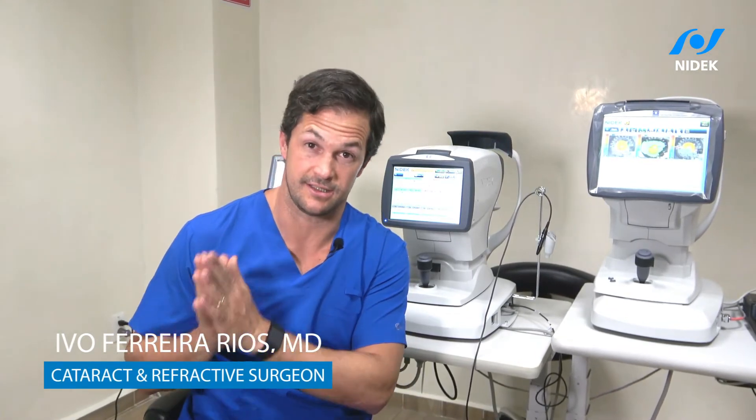We had the opportunity to use the YC200S Plus device as a slit lamp and SLT laser for glaucoma.